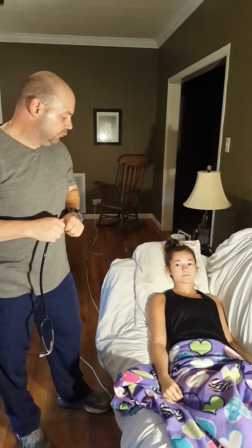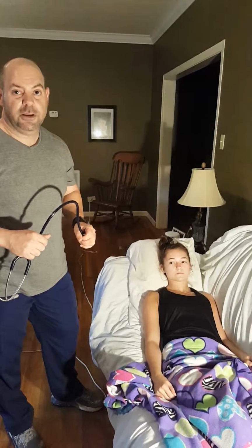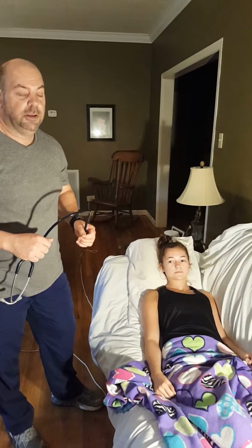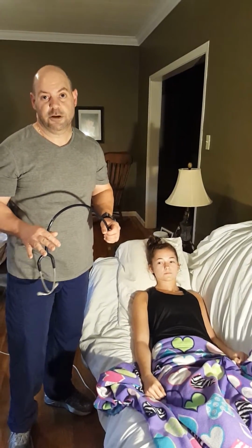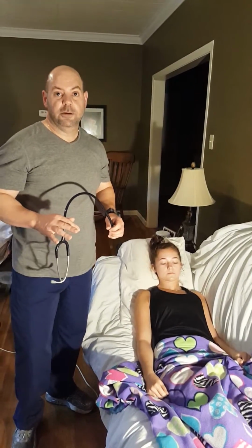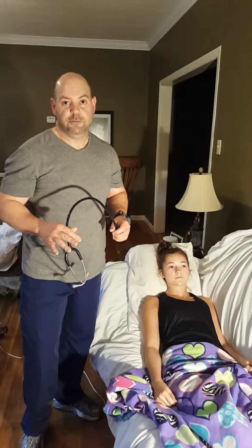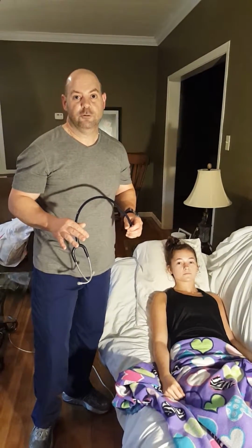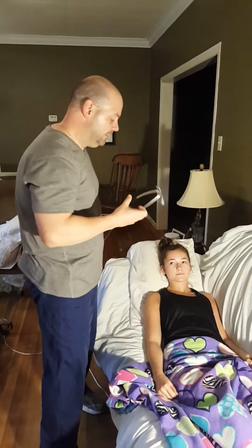First thing we're going to do, when I place the stethoscope on the carotids, I'm going to ask Ms. Landry to hold her breath. The sounds we should hear, we shouldn't hear any sounds at all, actually, which would be a normal finding. If we heard turbulent blood flow or a swishing sound in the carotids, this would be an abnormal finding, and we need to let the physician know. So now we're going to go ahead and listen.